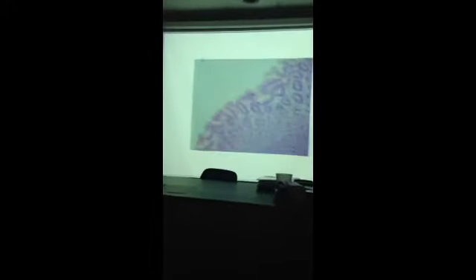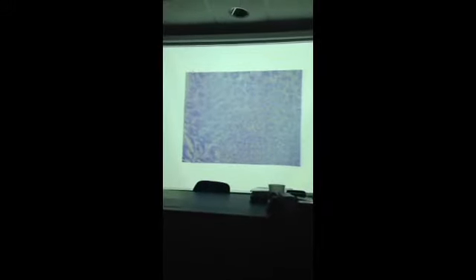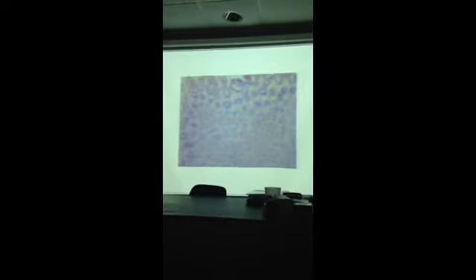What are those folds known as? Rugae, okay? They're folds in the mucosa and submucosa. They're temporary folds. That is, they flatten out when food comes into the stomach and distends or stretches the walls. You can actually see them here, some of the rugae. Okay, these large indentations are actually visible to the naked eye.